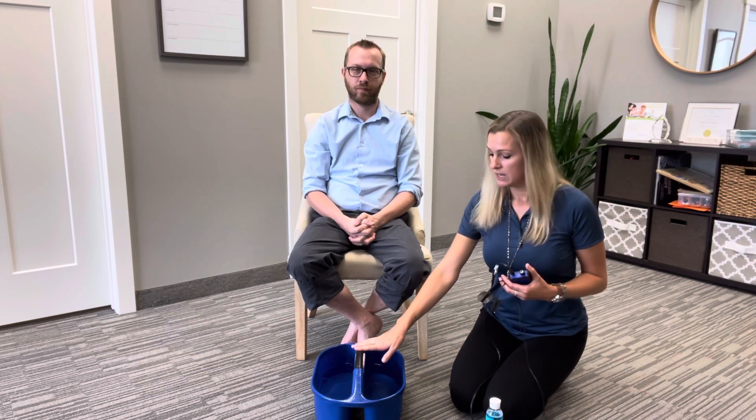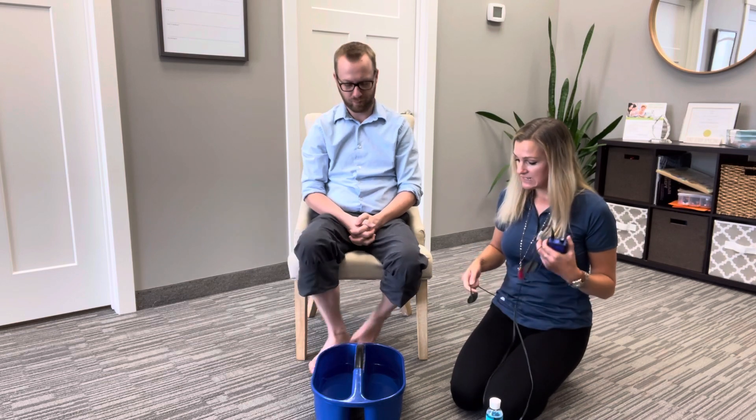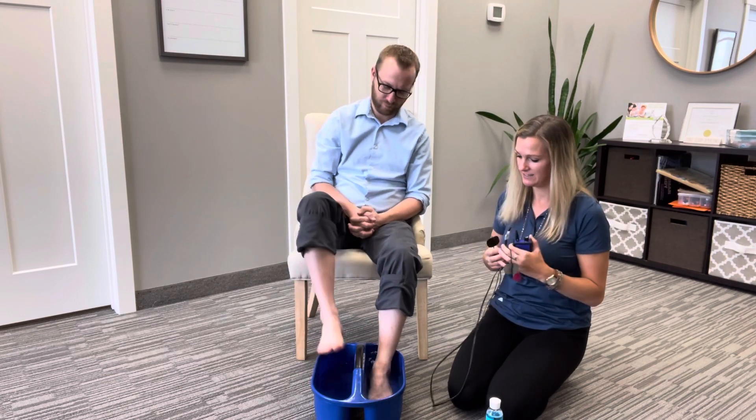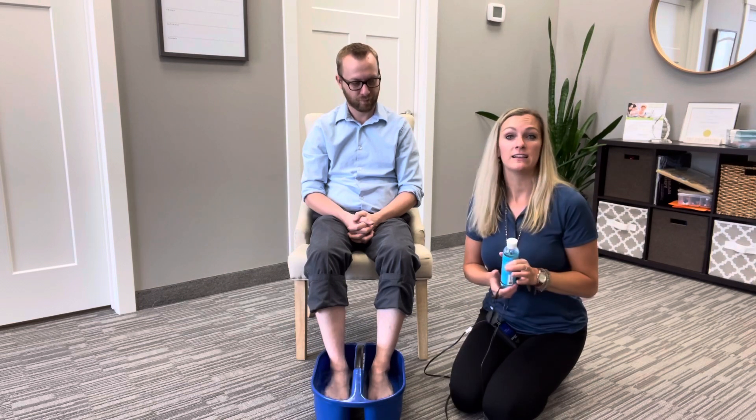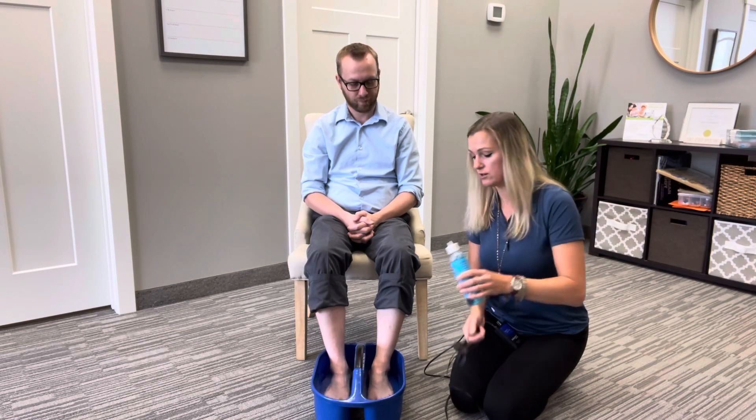This portion that we're going to show you today is for the foot neuropathy. Dr. Dan is going to put his feet in the water here. There is also a set of gloves that go with this to help treat the hands. So really easy to use — all you have to do is fill it up with warm water and Dr. Dan is going to put his feet in there. Then we add a little splash of an electrolyte solution, which helps the electrical current conduct better.